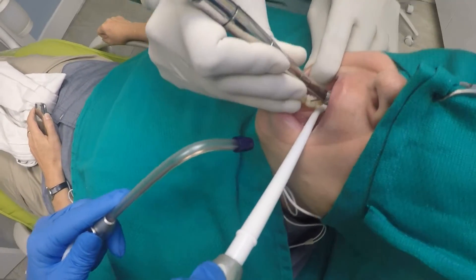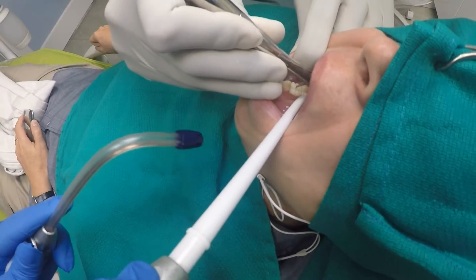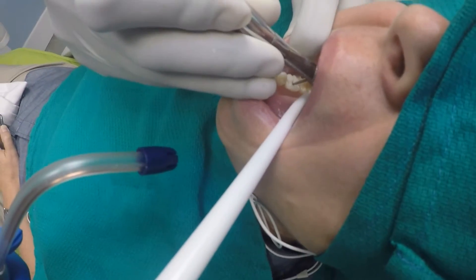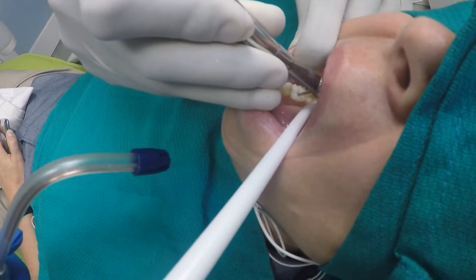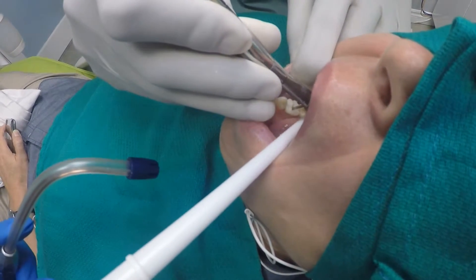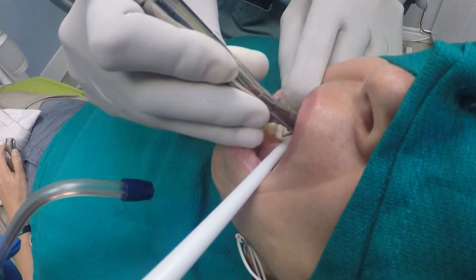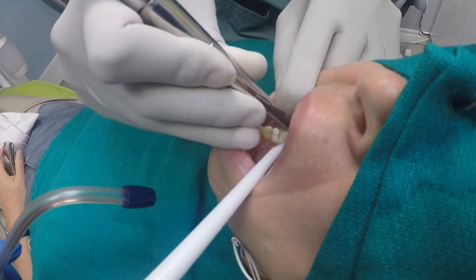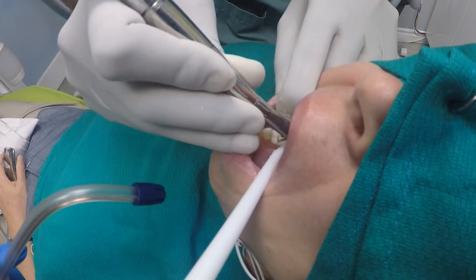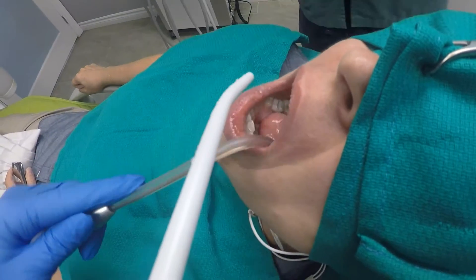In this video you can see that I'm using a high-speed handpiece with a 702 burr to create a section in the furcation area. The reason I use a 702 burr is because it is wide enough so that the shank of the drill doesn't get stuck. If you try using a regular 701, 557, or 245 restorative burr, you'll be limited in depth because the cutting component is narrower than the shank of the drill.